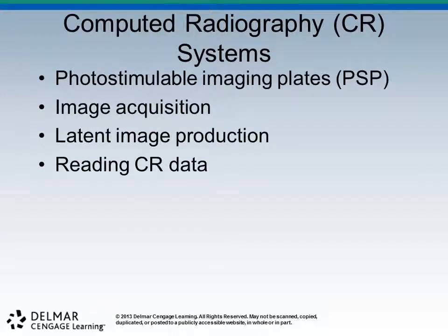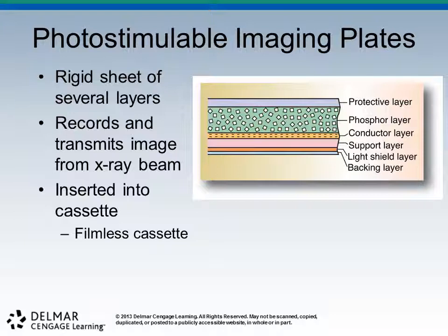How these things are put together, we talked about the other day. It's got that PSP plate, photostimulable phosphor plate. Let's go through this process of image acquisition that we've got here, okay? Strap in. The PSP plate, doesn't this look real similar to perhaps the intensifying screens and film discussion that we've had? Well, here's the actual active layer, the phosphor layer here. It's all sandwiched together, just like you might see in a deli or something. Each of these is adhered to the other.